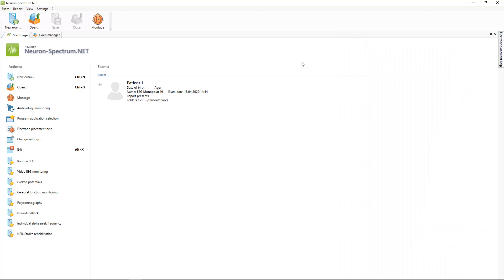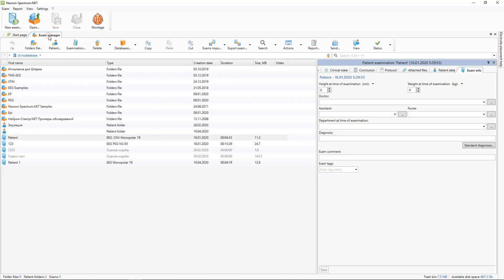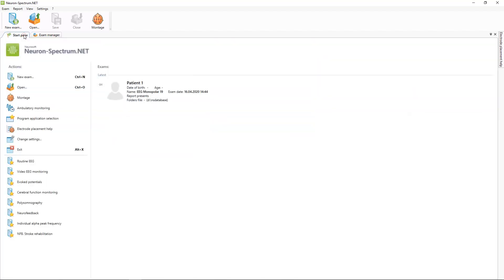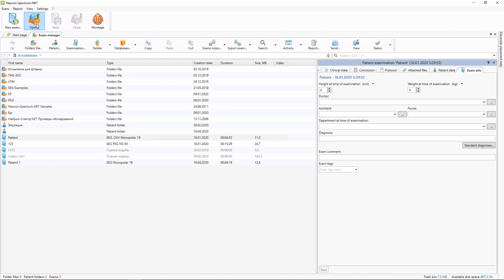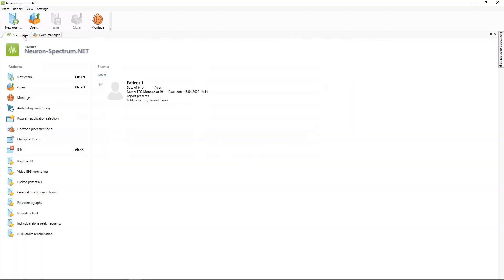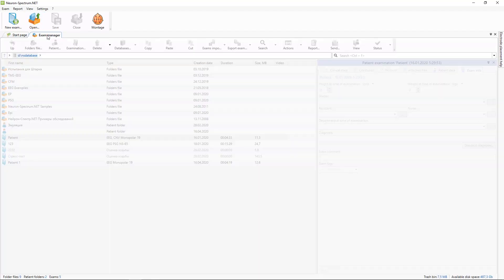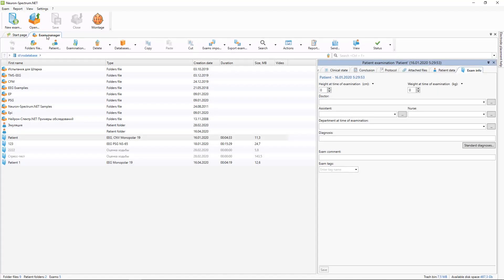Now to view the list of all your patients and examinations, you can use the exam manager window. You can open it with the open button or just select it in this tab.